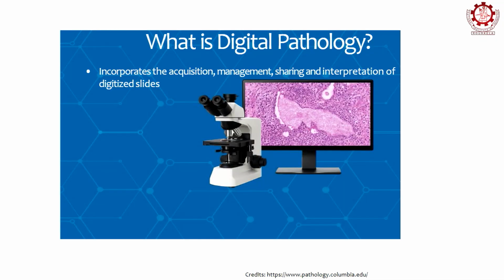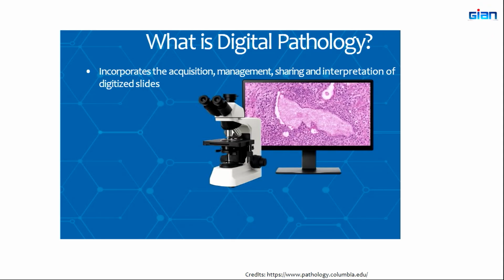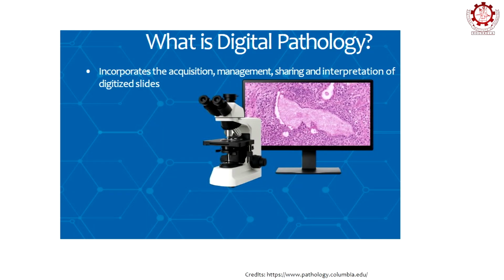So what is digital pathology? Like I said, it incorporates the acquisition, management, sharing, and interpretation of digitized slides. All of these terms are important because by combining them, we have essentially moved from a more traditional analysis of these pathology images to a more modernized analysis, where the pathologists look at these images on the screen.